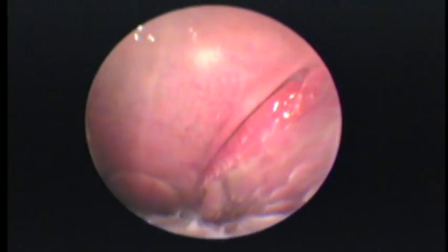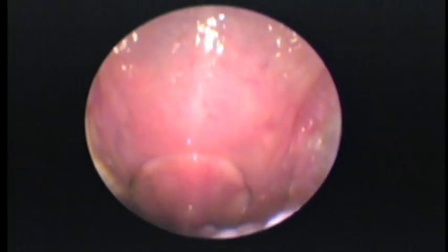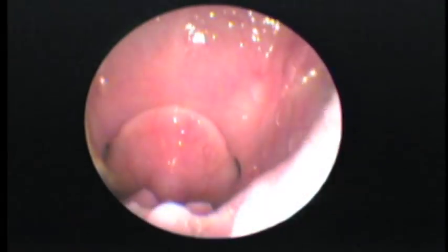We're going to do an examination on this Norwich. First on our way in, we're going to look at the tonsils. We want to make sure the tonsils aren't really enlarged or irritated in this dog. They're a little bit out of the crypts, but they're normal.